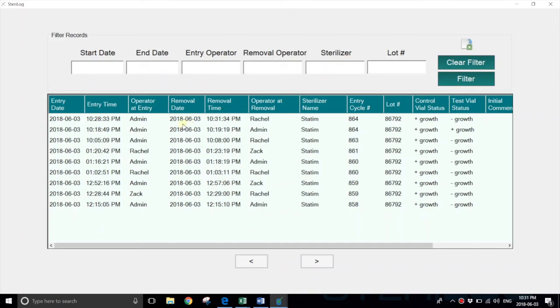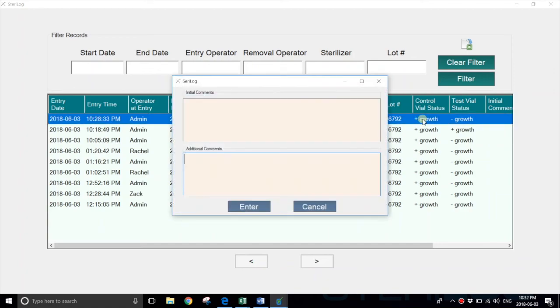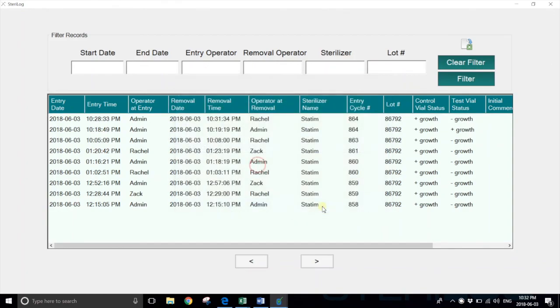You can also see the operator at removal, the associated sterilizer name, entry cycle number, the lot number, and the test results. Here the user can key in comments by selecting the row, and again they can export to Excel or filter on any particular results.